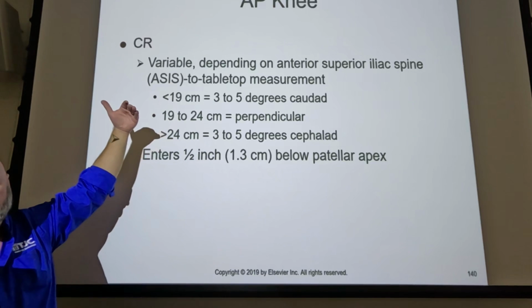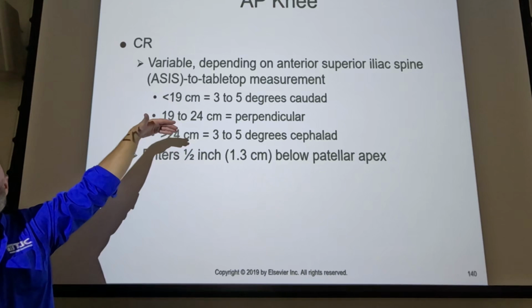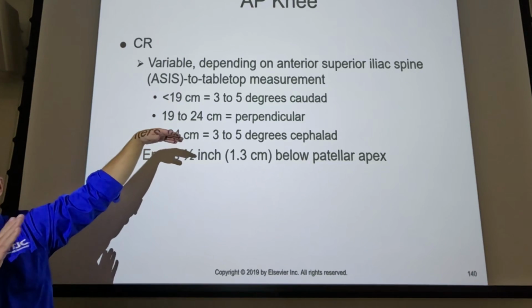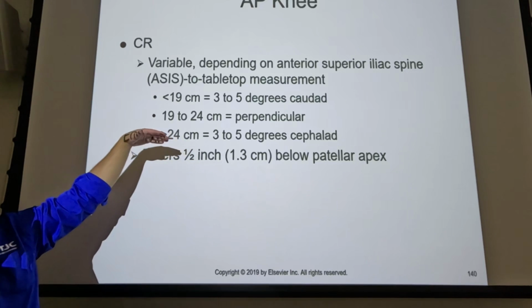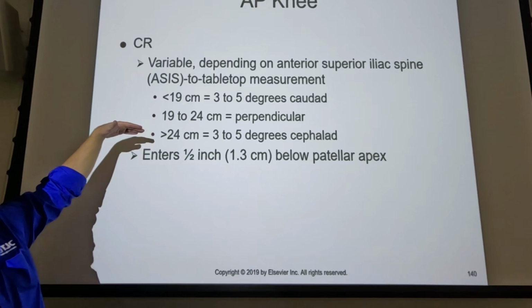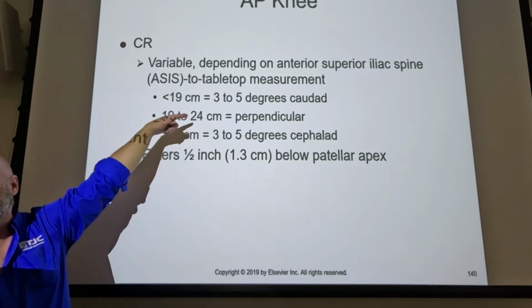The man is well over 400 pounds, and it's all gut. But you could plumb a wall with his butt. He has none. It's as flat as it can be. So he's hypersthenic, but that distance may not be reflected in this.